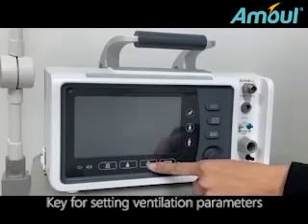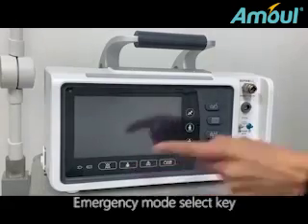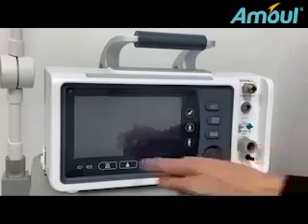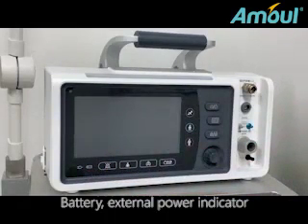Key for setting ventilation parameters. Emergency mode select key. Mute key for voice alarm. Battery external power indicator.